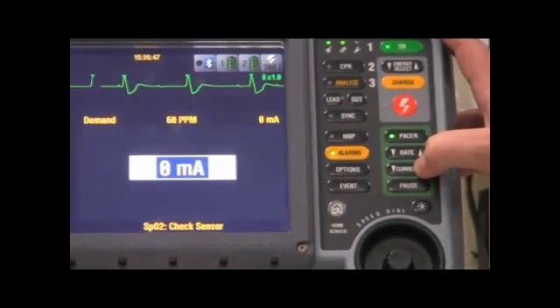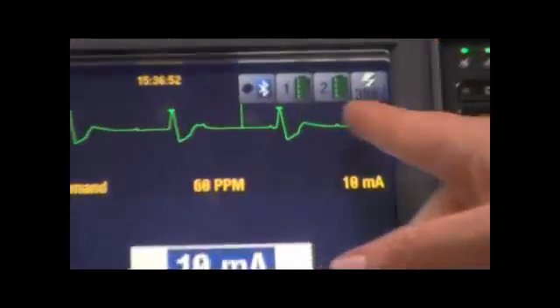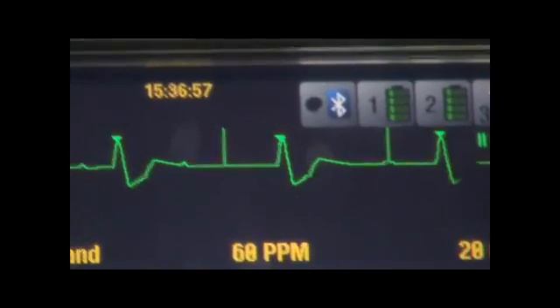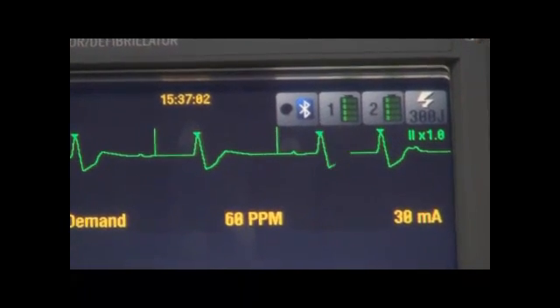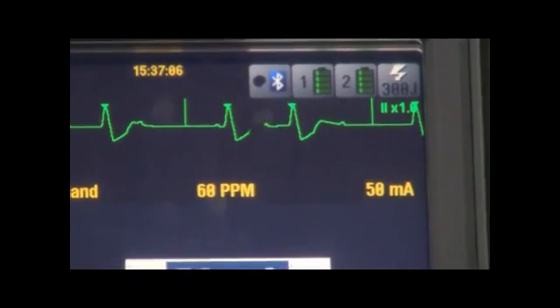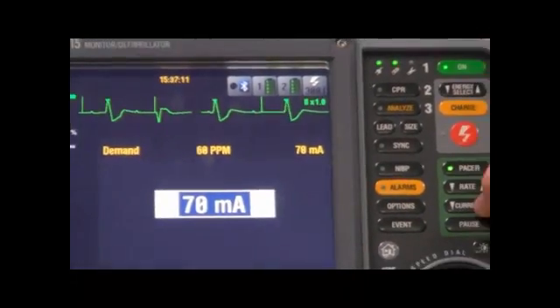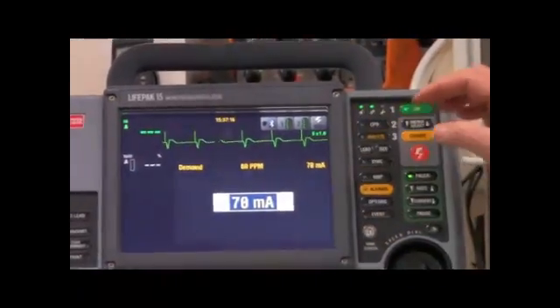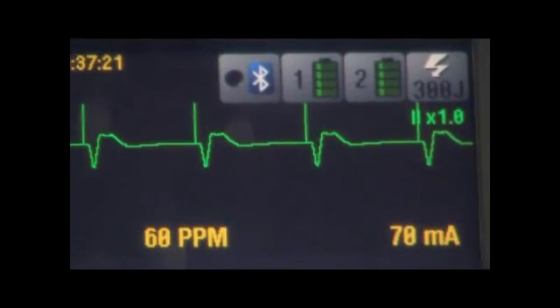So if we start at low milliamps, you can see that it has been delivered, but it's not capturing with the QRS, so you keep turning it up until it captures with the QRS and increases the heart rate accordingly to what we've set, which was 60. So there we go. We can see that it's pacing, the electricity is delivered at the start of each QRS. And that's basically all that there is to pacing.